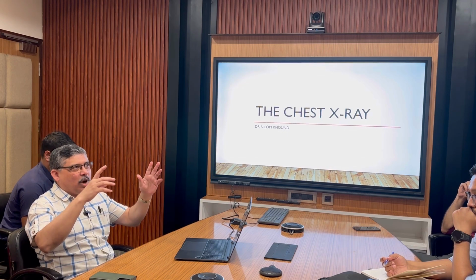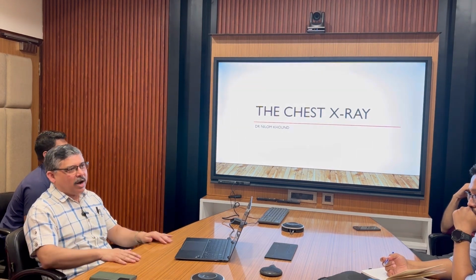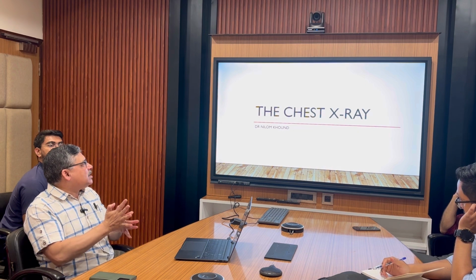I will teach you the method of actually seeing an X-ray. That is basically required. You may not be able to see everything in your postgraduate days. So we start. So, X-ray.